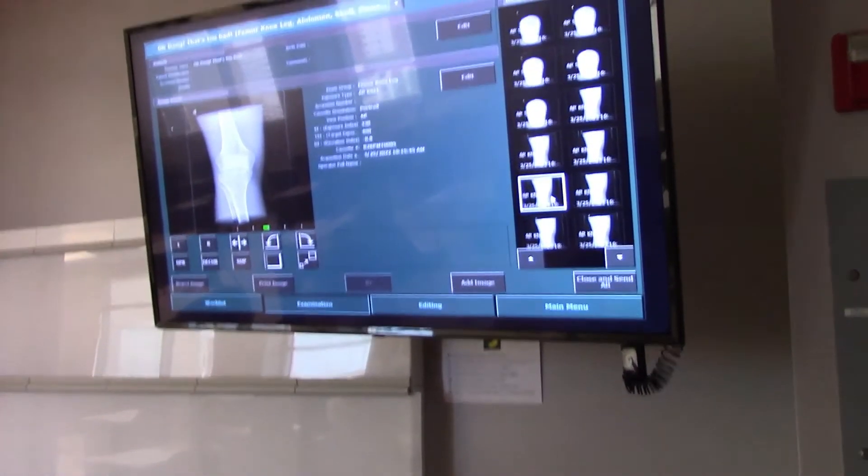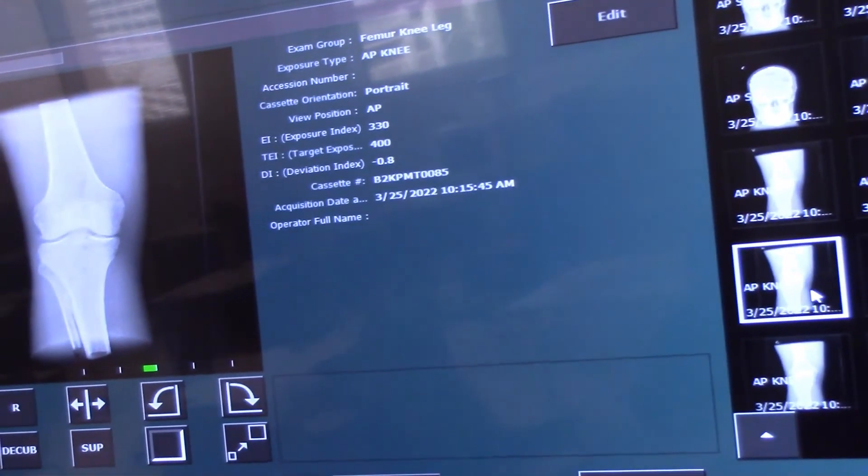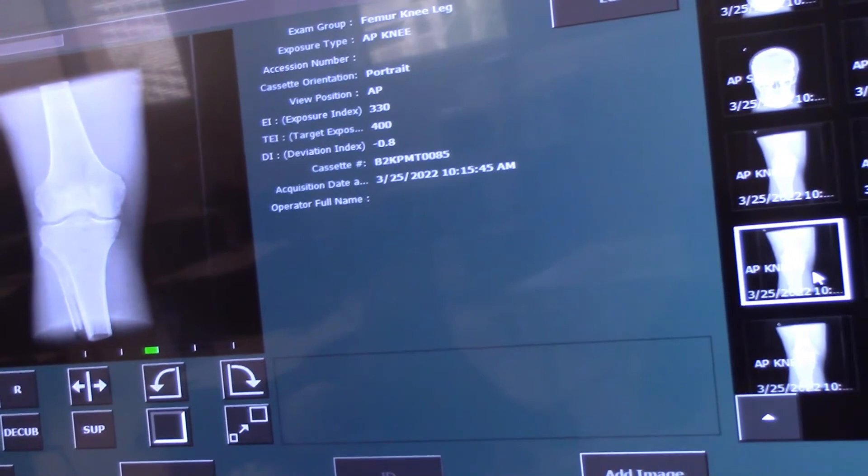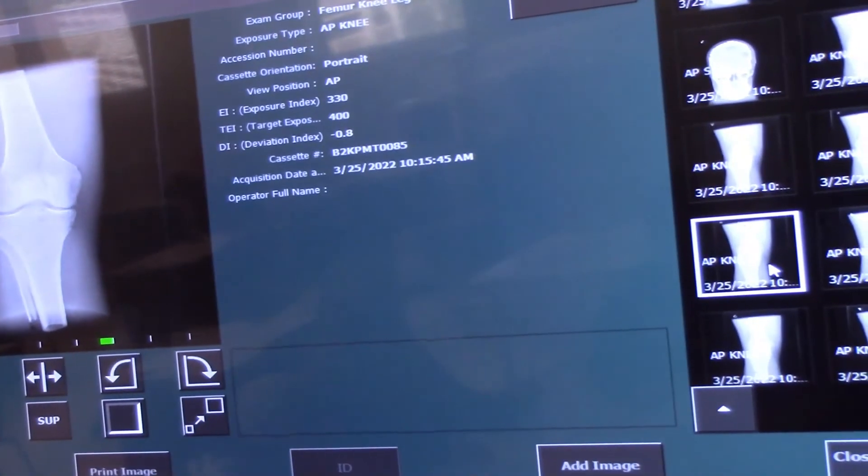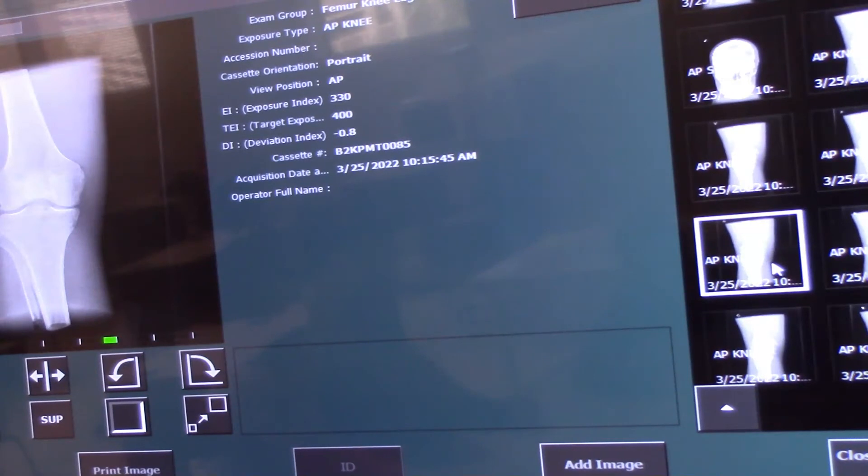Some of our knees were way overexposed and some were way underexposed. This one was the best one we had and it had a deviation index of negative 0.8. What was the technique on this? This was 58 kVp at 6.2 mAs. So that's going to be our jumping off point. We're going to make this our baseline.